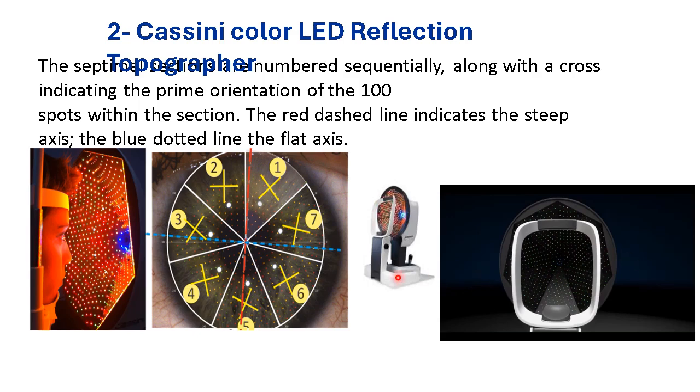And these are multiple spots with very high precision in microns. So it gives very good information about the anterior surface of the cornea.